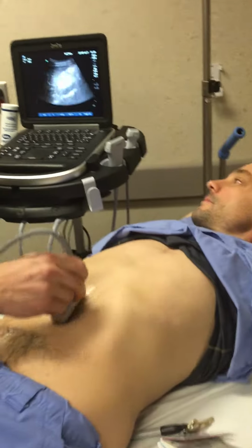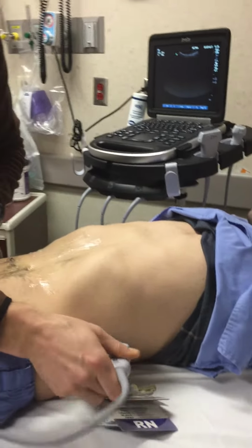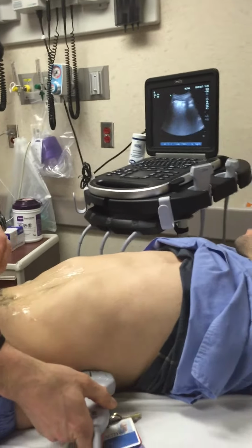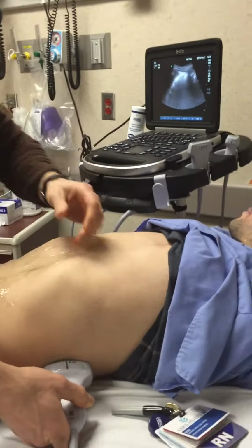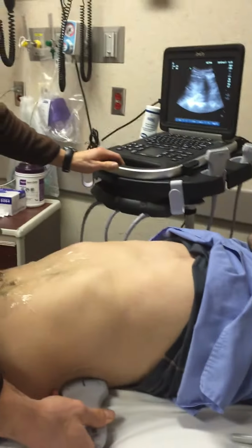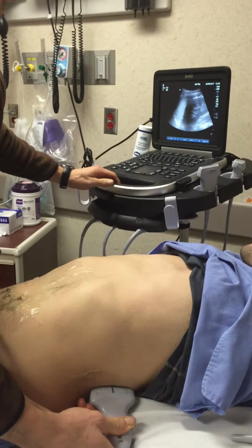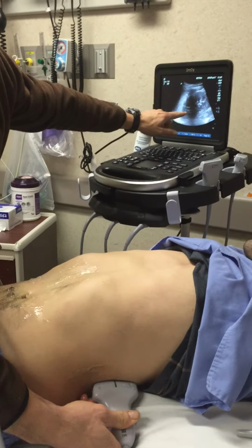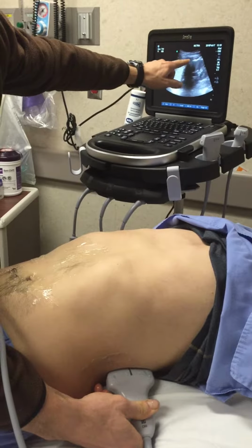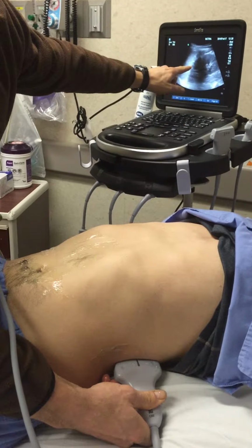Moving over to the left quadrant, it's a little bit more posterior. Again, I'm in a longitudinal sagittal view. And there's the kidney there in view. And so ideally you want to try to catch the spleen-kidney interface. So there's a rib shadow on the screen. You're looking for fluid to collect between the spleen and the kidney here on the left side.